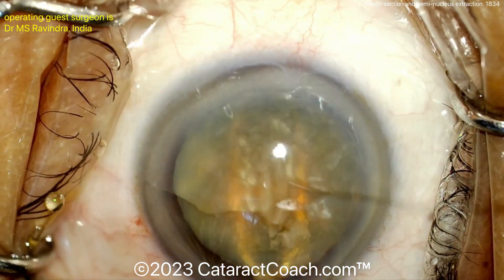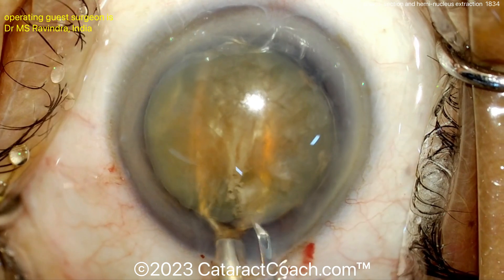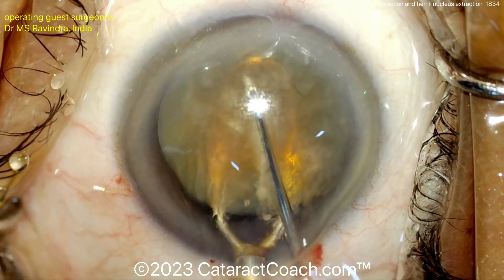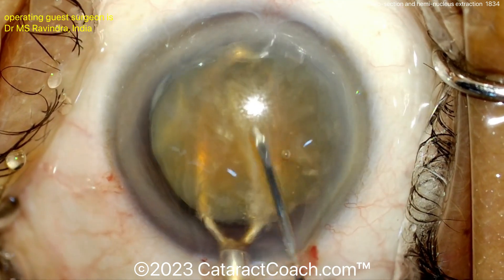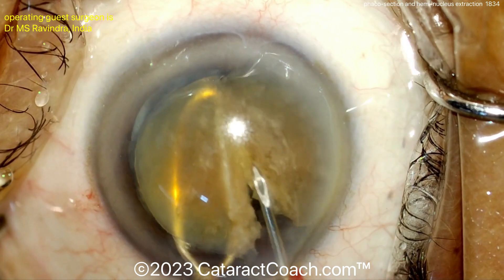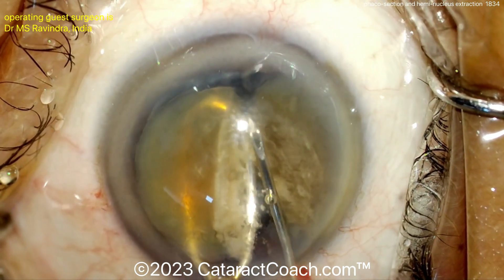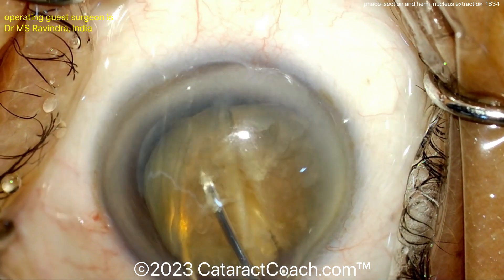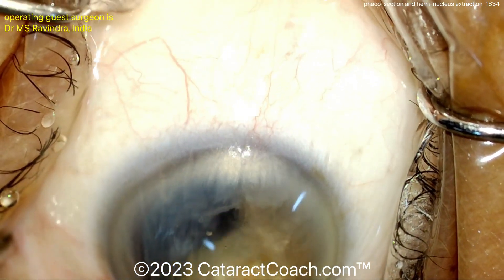You can see there's a vectis underneath it to hold it, and now he's making a little score down the middle with a blunt cannula. That lens loop or vectis is underneath it to hold it, and now using a sharp 27-gauge needle — applying pressure, using the sharp end of it like a cystotome — to cut that nucleus into two halves. Very nicely done.